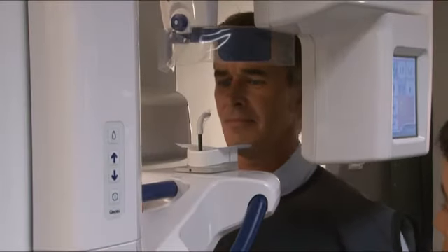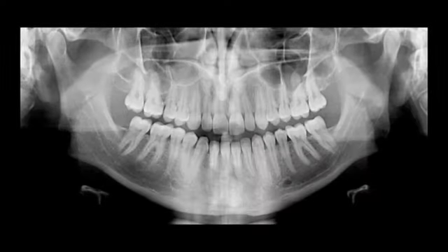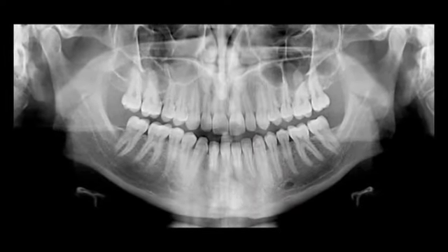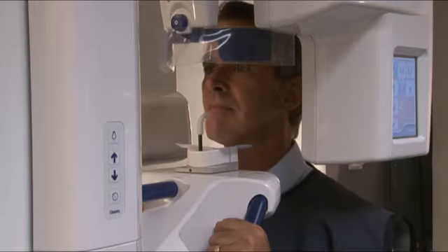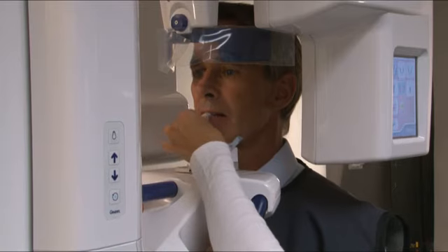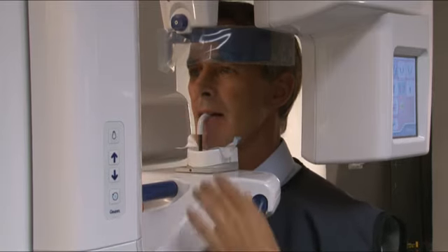Ask the patient to step into the unit and grab hold of the hand grips. Excellent image quality such as the image displayed here is a result of careful attention to positioning. Ask the patient to rest his or her chin on the chin rest. Dentate patients should place upper and lower anterior teeth into the groove on the bite guide.